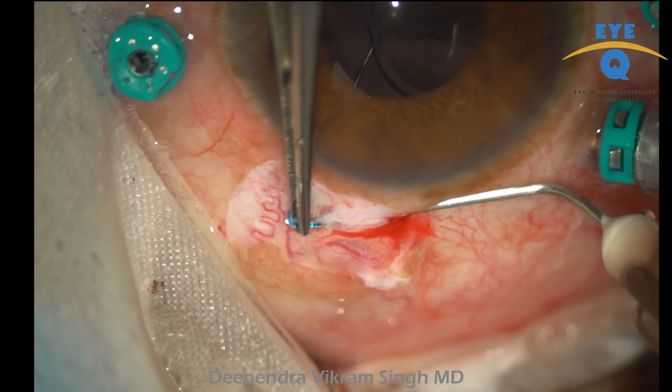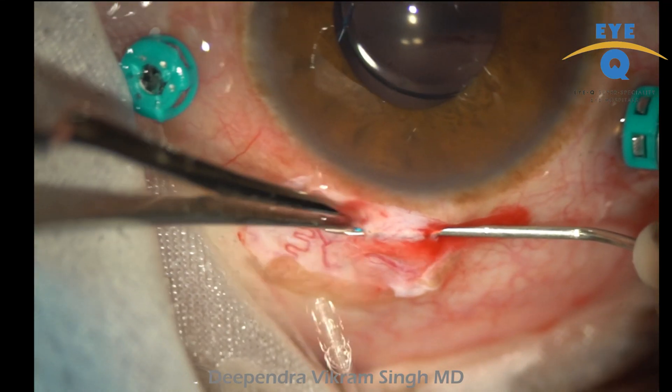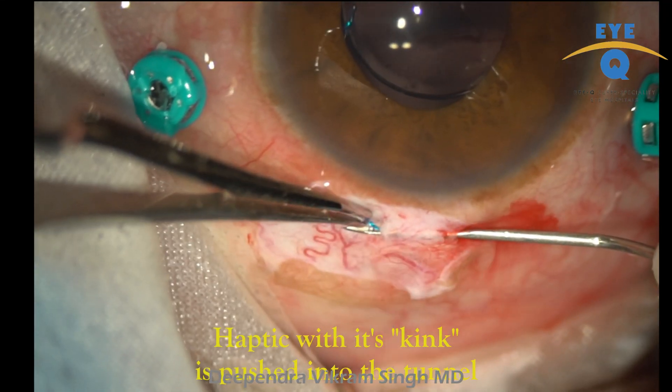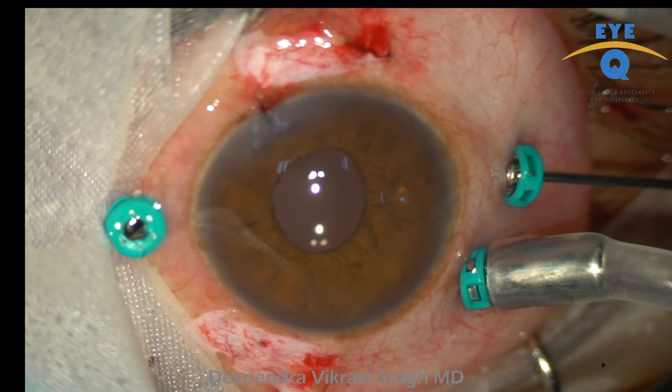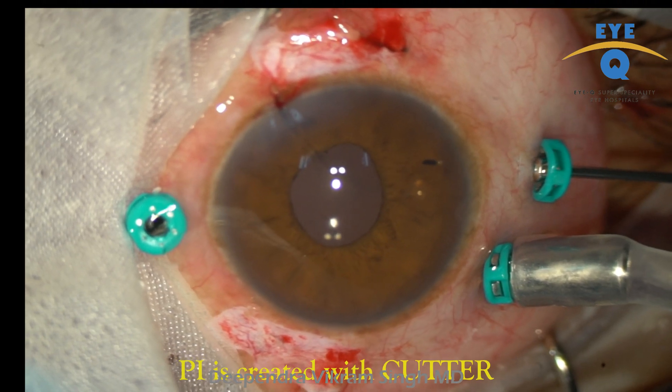A scleral tunnel is created with a bent 26-gauge needle. One can notice a kink in the inferior haptic; this kink is pushed into the tunnel. One can see that the IOL is well-centered.